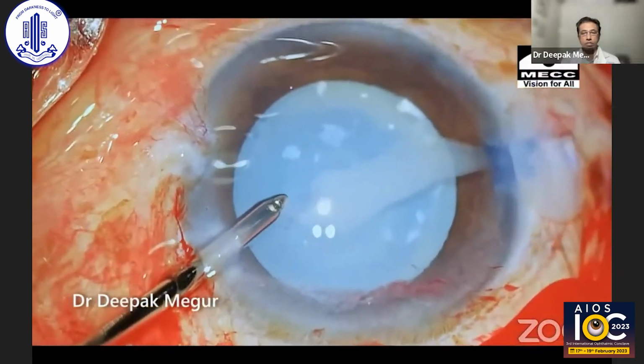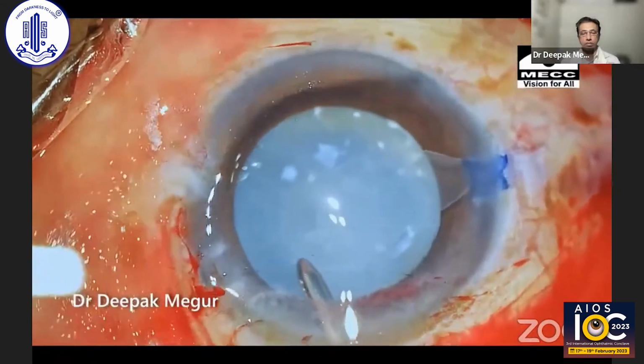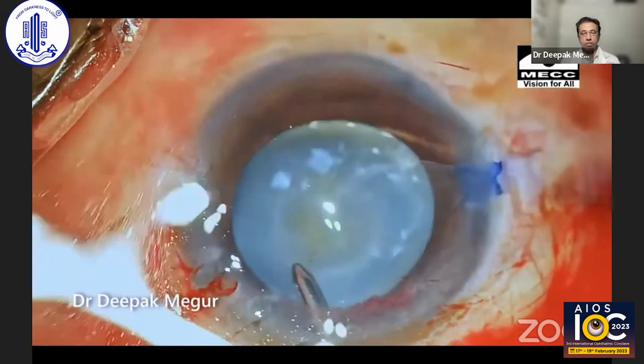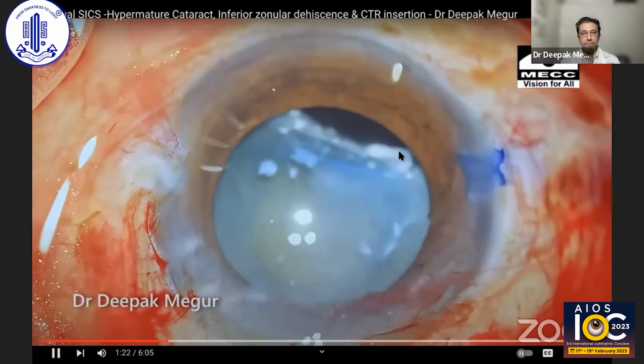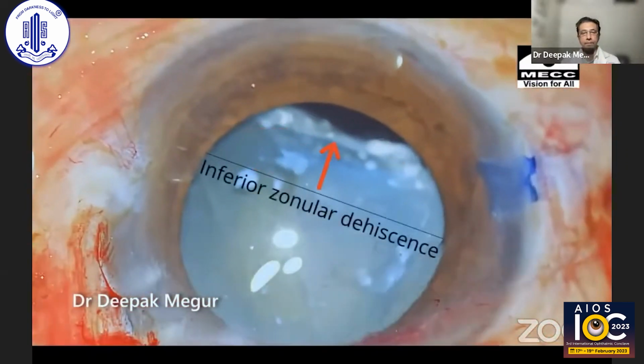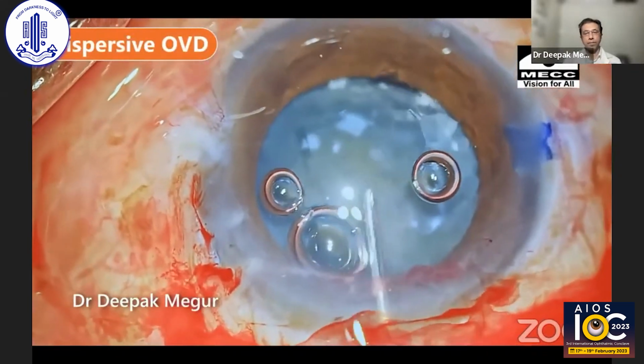So as expected, once I puncture, there is an egress of liquid cortex out here. To improve visualization, I'm doing gentle irrigation to ensure that the fluid comes out, and suddenly I can see that the inferior bag just folds up, suggesting that there is a localized area of zonular weakness, and probably vitreous would be trying to come out there.